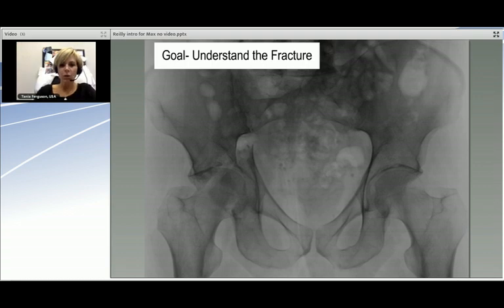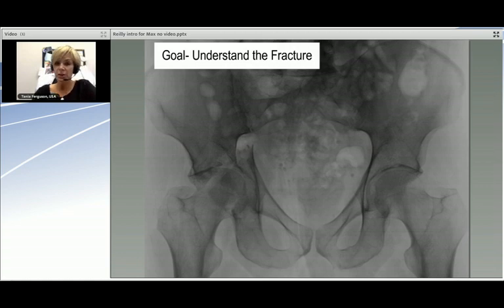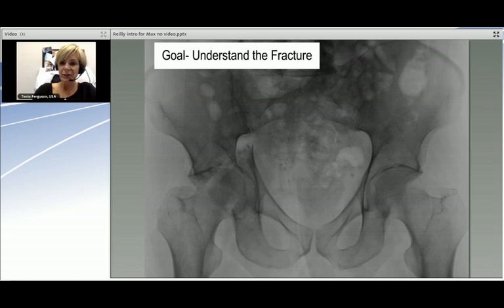The ultimate goal is to understand a fracture well enough, based on the plain films and the CT scan, to be able to take it to the operating room with a comprehensive preoperative plan. That's dependent on understanding the fracture far better than just being able to say this is a transverse posterior wall fracture. Dr. Mark Riley is going to take us through this particular fracture.